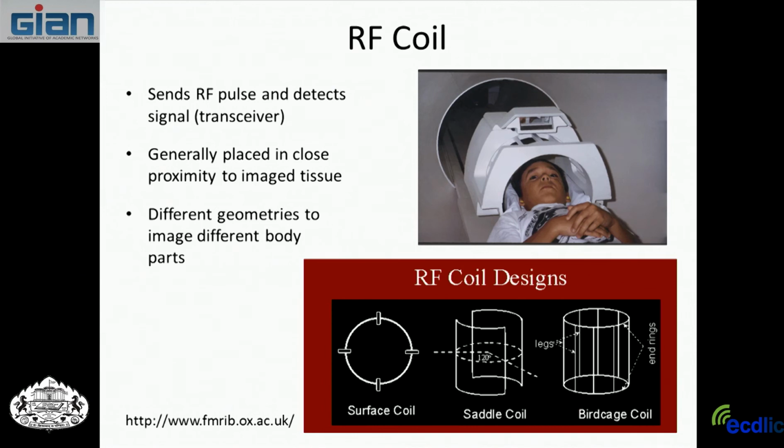And you can see at the top here how close this RF coil is to a person's head when you put them in the magnet. It's this little box area, and it actually snaps onto the table when we put a person in there. And this is a kid, so he's not too uncomfortable in there. But if you get a really big guy in there, sometimes their nose is only maybe a few millimeters from the coil. And that can be pretty intense and intimidating, especially if it has to be on there for a long time.